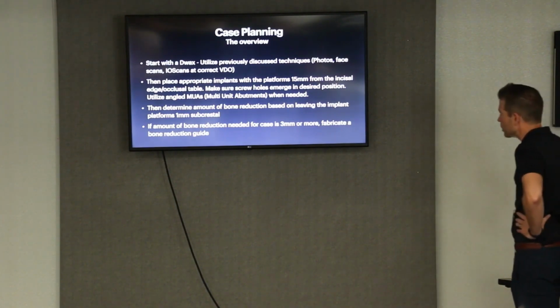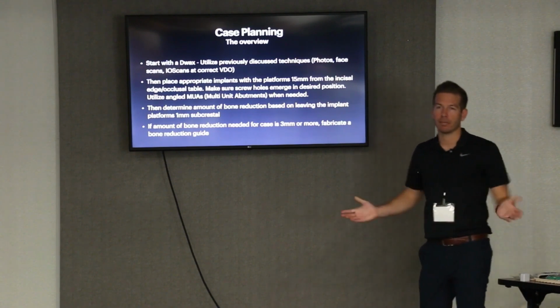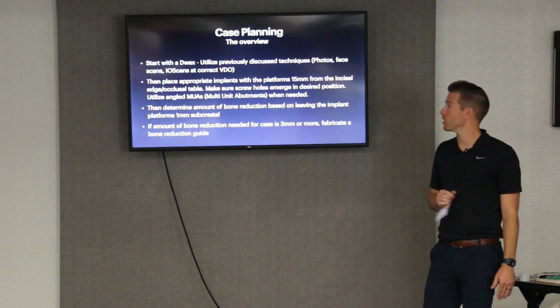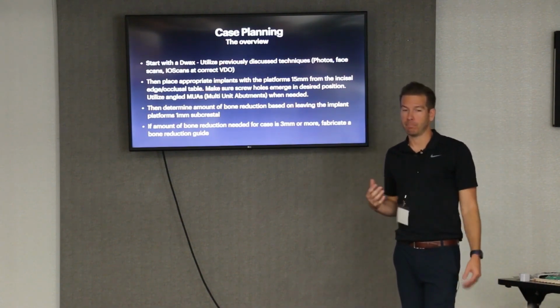Planning, the most important aspect is the digital wax up. So really, we talked about this last time when we did the dentures. It's really the same thing. That's where we start.